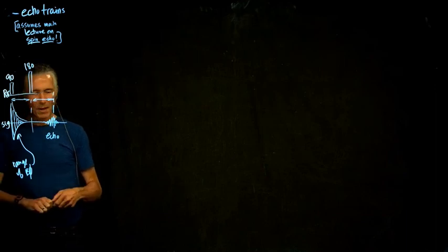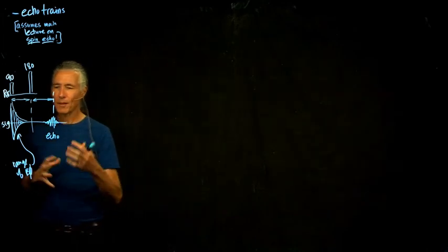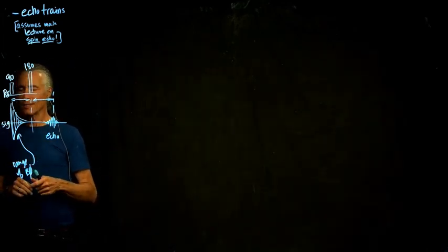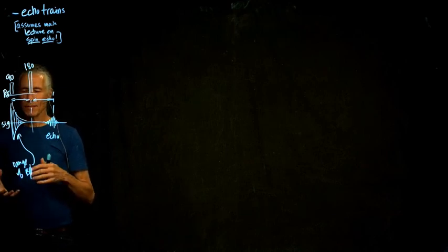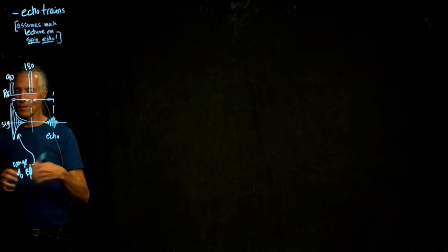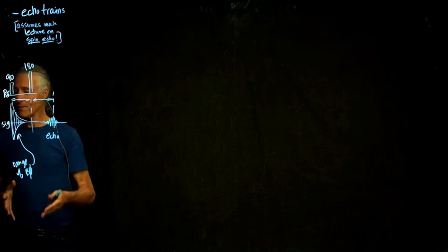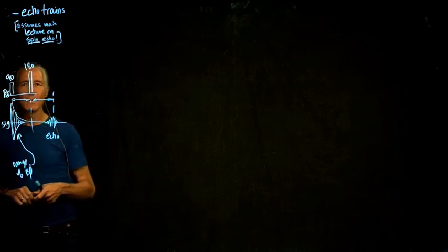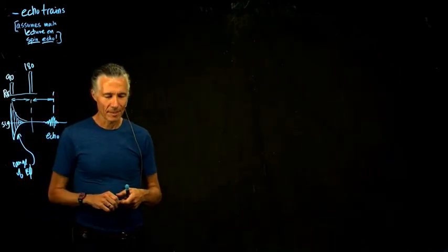One of the main problems in thinking about how to design a pulse sequence with MRI is that you actually have to deal with all these various echo pathways so that they don't cause artifacts. The source of a lot of artifacts are all these additional echo pathways.